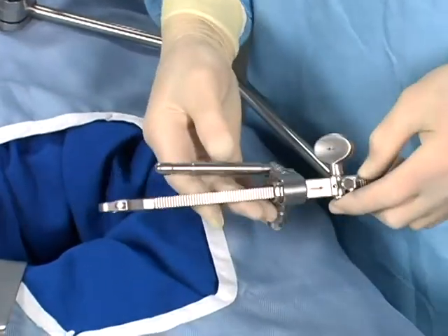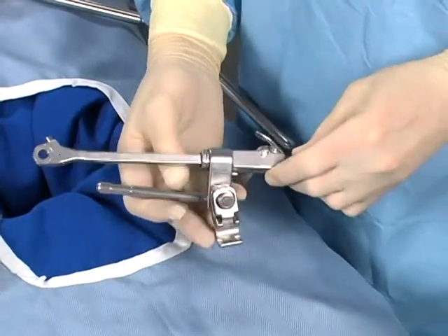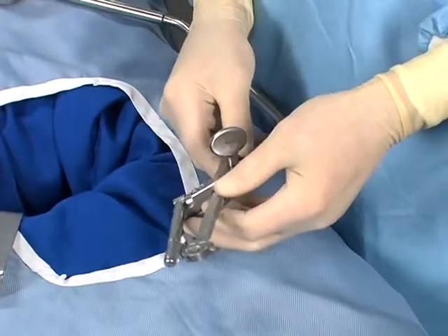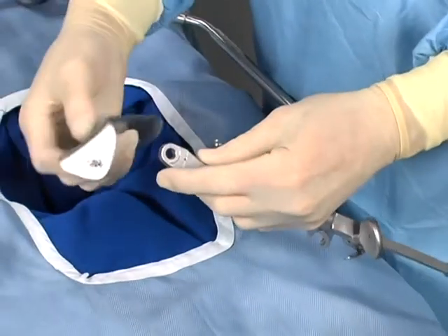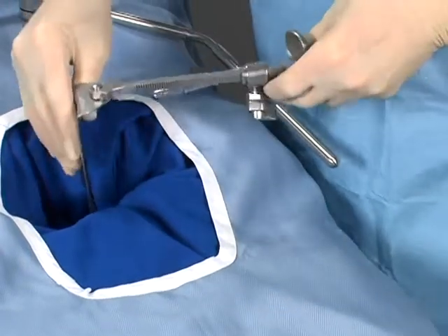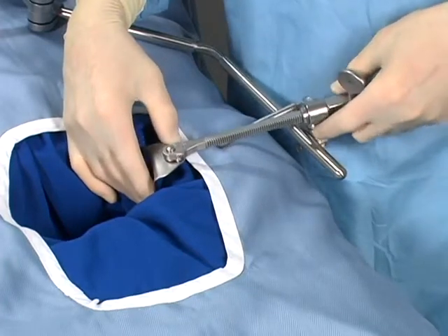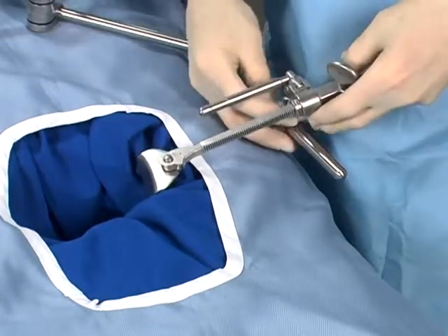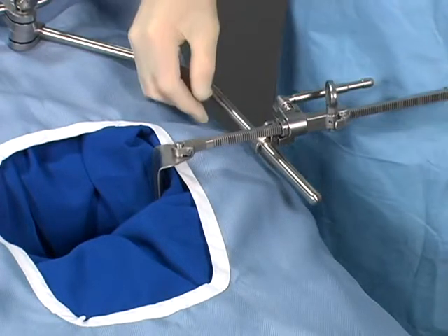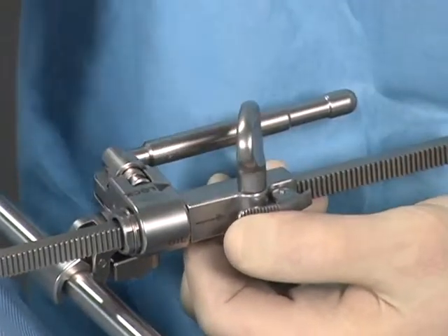For the Crank 2 clip-on joint, for micro-adjustability and increased leverage, use the crank handle. The ratchet mechanism provides exceptional power and the interchangeable head of the handle is adaptable with all of the interchangeable blades. Simply attach the retractor blade to the Crank 2 handle, position the blade in the incision, clip the Crank 2 onto the arm, retract, and lock the cam. Retractors may be adjusted manually or by turning the low-profile knob to fine-tune retraction. Release the retractors by simultaneously turning the knob and pushing in on the pawl.